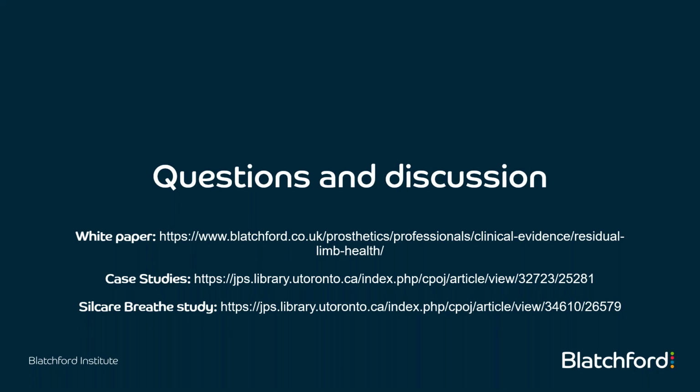And obviously, the people that are using elevated vacuum need to have good cognitive ability to understand what's going on and recognize if the leg's not fitting, why it's not fitting, what's going on. And like anyone, they should inspect the residual limb at least once a day, just to make sure everything's all right. So good cognitive ability, and make sure that they're not fluctuating a lot. Those are the sort of people I wouldn't put on it to start with.